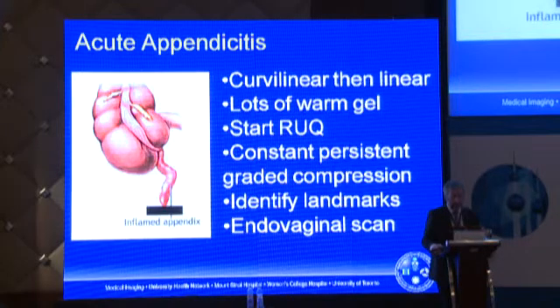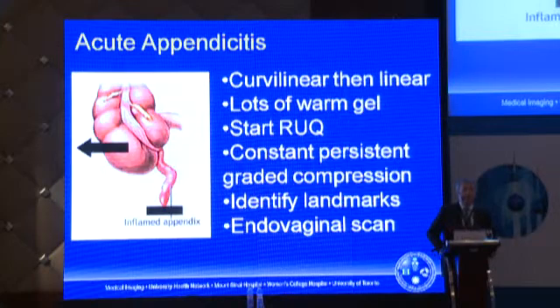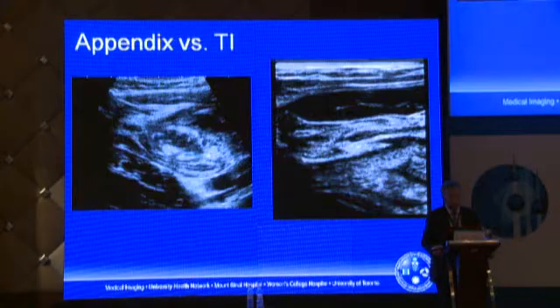And all the time, I'm trying to push the cecum high and lateral, because if I can control the cecum up here by pushing the rectus abdominal muscle back on the psoas muscle, I have a good chance of trapping the appendix draped across the psoas muscle, and I have a very good chance of being able to assess it well with ultrasound. So that's the goal. It isn't always that simple, but that's what I try to do.